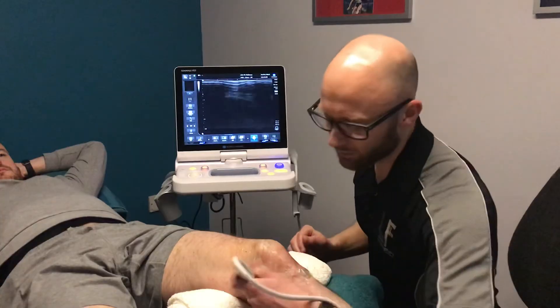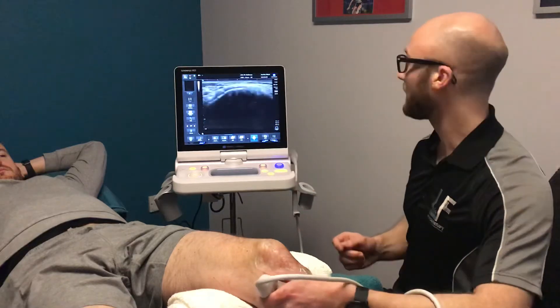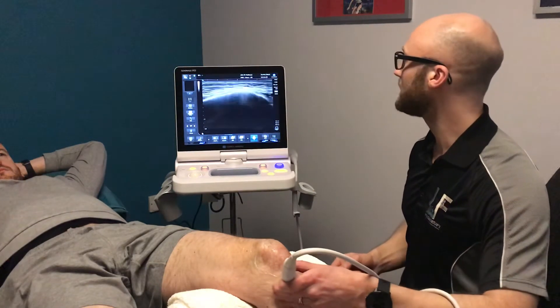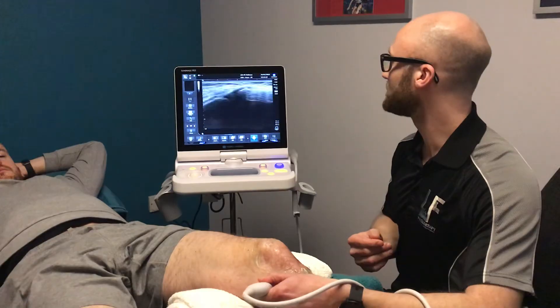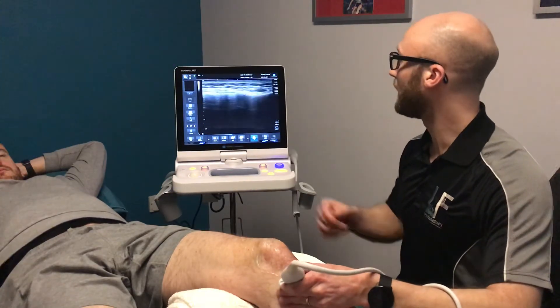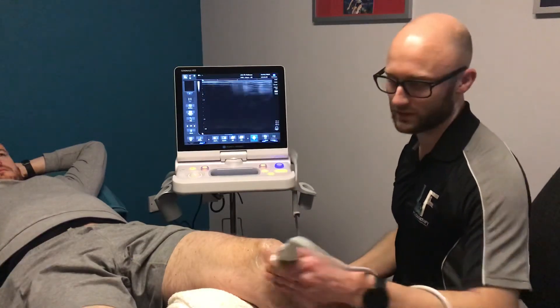We won't see it particularly well in this position, however we can assess the bottom end of some of the hamstring and adductor tendons that come down into this part of the knee. We normally change the patient's position to visualize them more readily, but this point here is known as the pes anserine — the attachment of some of these tendons.